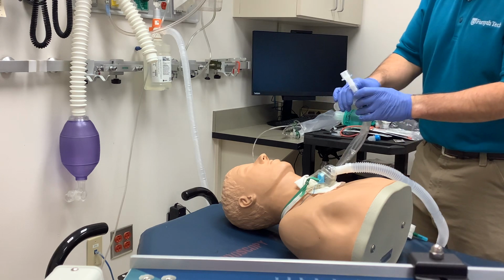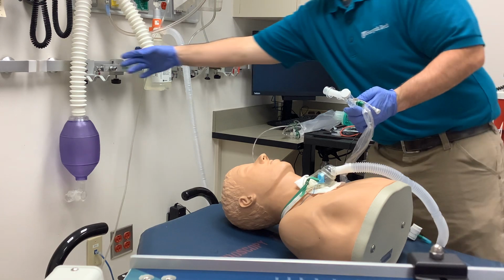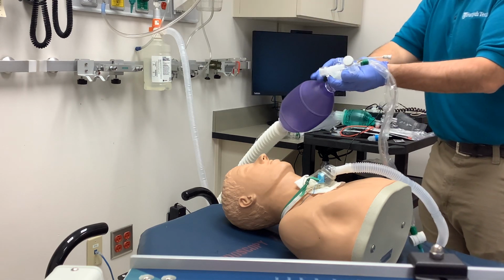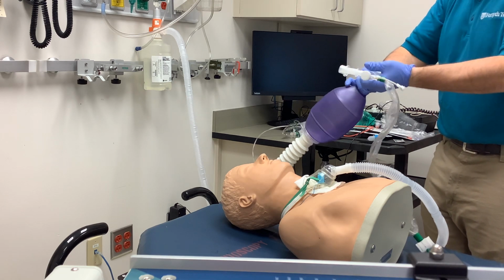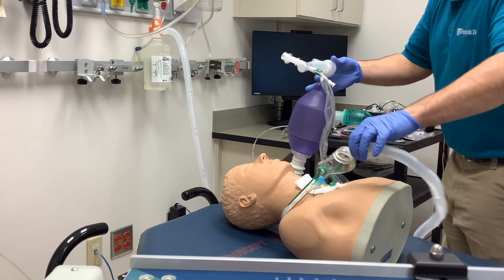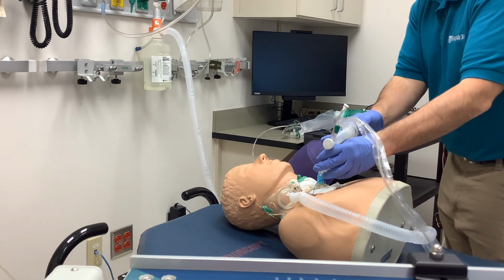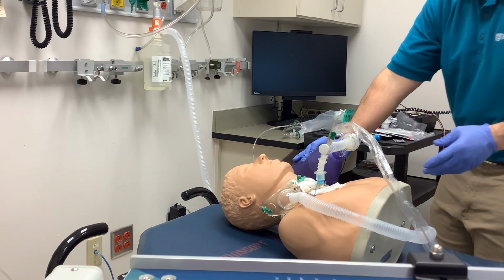So one thing we can do here is take your manual ventilation, your bag valve mask. This does increase dead space a little bit, but you're only going to be utilizing it for a short period of time because you still got your exhalation valve here. So if you wanted to, you can take the tracheostomy collar, move it to the side, and now you have the ability to attach this to the tracheostomy tube, and you can breathe 100% for your patient.